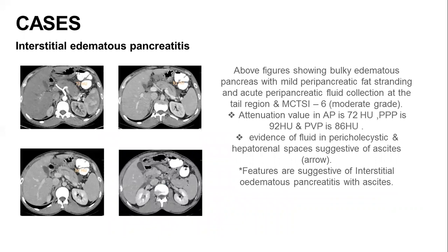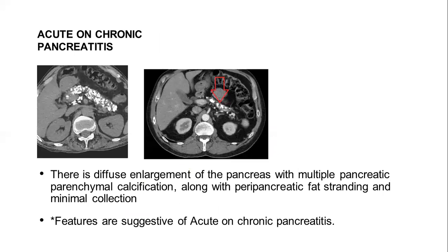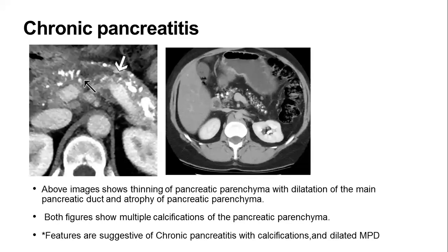This is a case of interstitial edematous pancreatitis in which the pancreas is bulky and edematous with mild peripancreatic fat stranding and peripancreatic fluid collections. This is a case of necrotizing pancreatitis in which the head, body, and tail of the pancreas are bulky with parenchymal necrosis and peripancreatic fat stranding. This is a case of acute on chronic pancreatitis with diffuse enlargement of the pancreas, multiple pancreatic parenchymal calcifications, and peripancreatic fat stranding.